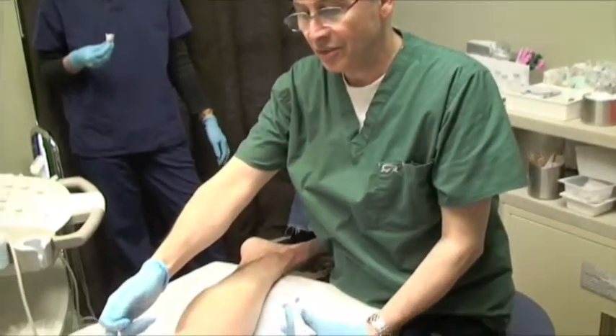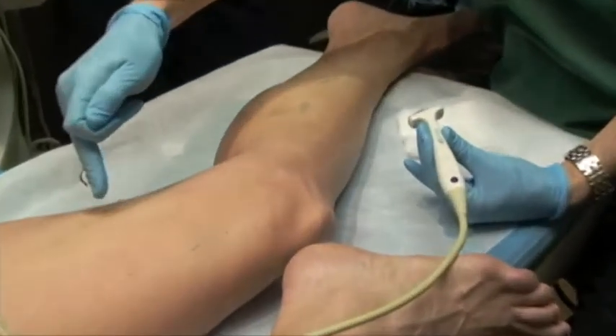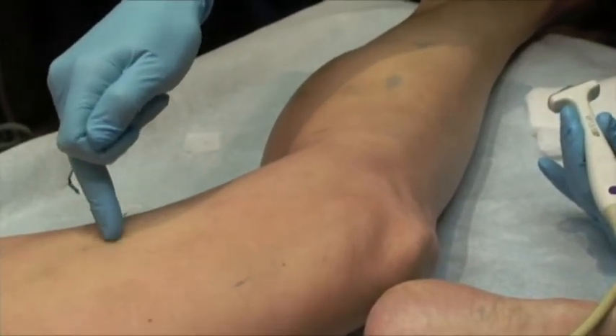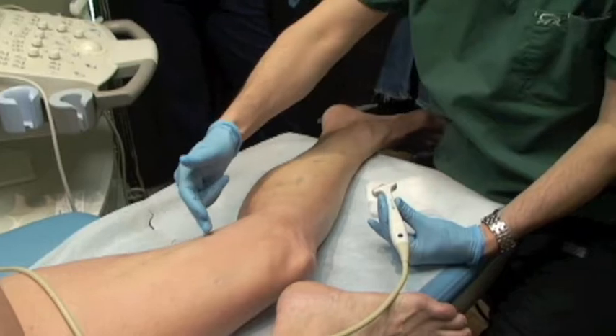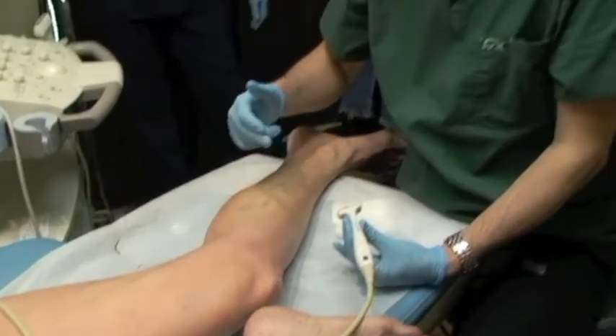We're treating reflux in the distal right great saphenous vein, with the original reflux being the Hunter's perforator and not at the SFJ. We'll treat in a way that we close the perforator and this distal part of the great saphenous vein without leaving any medication or foam in the vein.